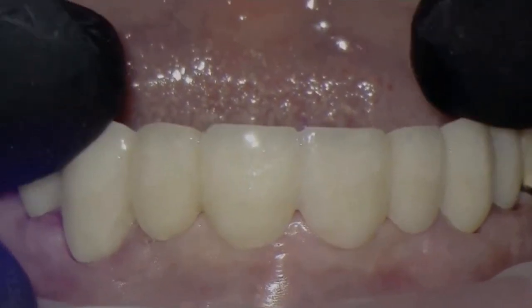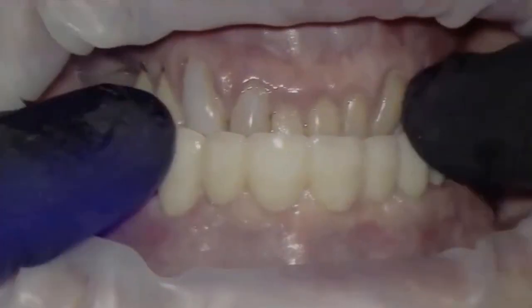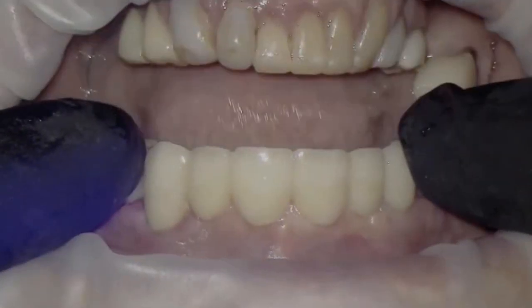This is the prep, doctors. This is the way that we prep. If I had defined margins, a chamfer or shoulder, it would be very difficult to have a restoration fit this way. But modifying our preps, and because we are bonding these restorations, I think the feather edge or the knife edge prep today is one of the most beautiful materials that we can use.